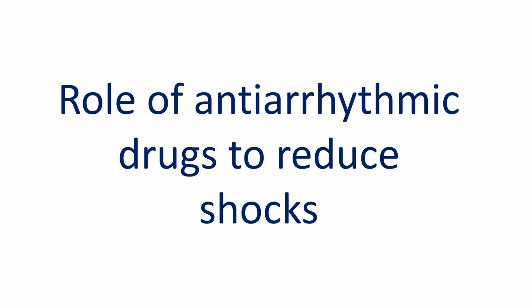The battery life of the ICD depends on the number of shocks it is called upon to deliver and the energy levels needed for each shock. Antiarrhythmic drugs can be used to suppress ventricular tachycardia to reduce the potential need for shocks, but there is a caveat. Breakthrough ventricular tachycardia can occur at a lower rate, below the programmed detection rate of the ICD. Recurrent slow ventricular tachycardia has a potential to cause tachycardiomyopathy. Antiarrhythmic drugs can also increase the defibrillation threshold and require higher energies for a shock to terminate VF.